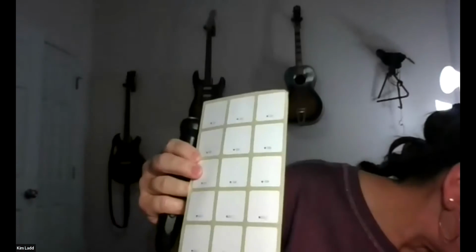It has a couple buttons on it and you turn it on and it will read labels for you. So they all come with labels, different sizes. And these labels have the ability to record information. I have never reached the limit. I think each one can save like 3 hours or something, so it's really good that way. Let me get my labeled ones out here.